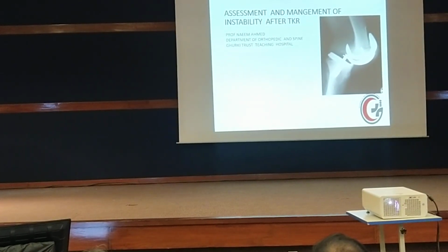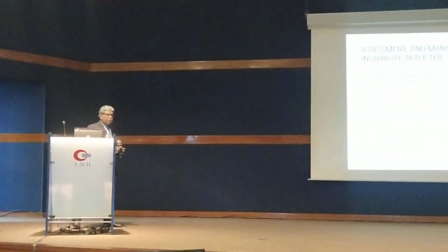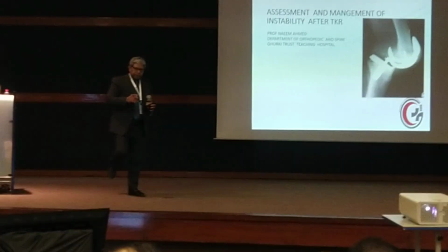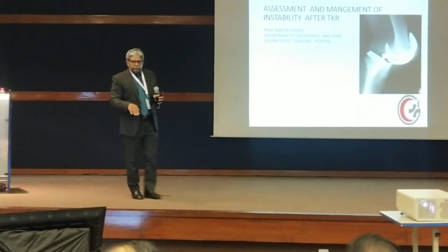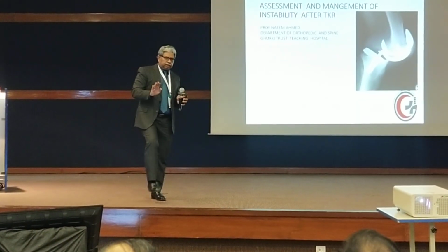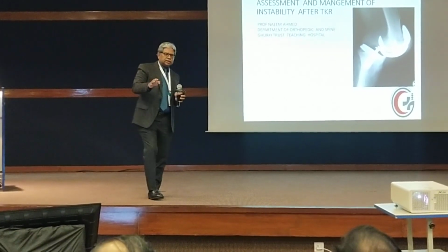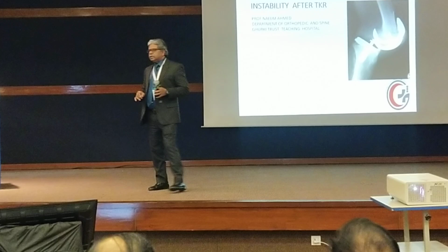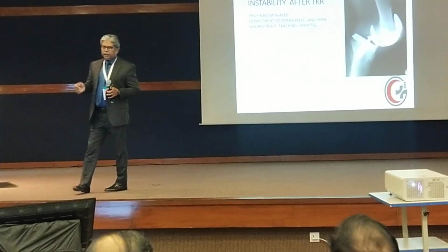Any question? How can you assess for mid-flexion instability? Mid-flexion instability, you always check in flexion, and when you check the range of movement, the patient has something like a click sign or clunk sign, or sometimes the patient feels a little bit of pain.